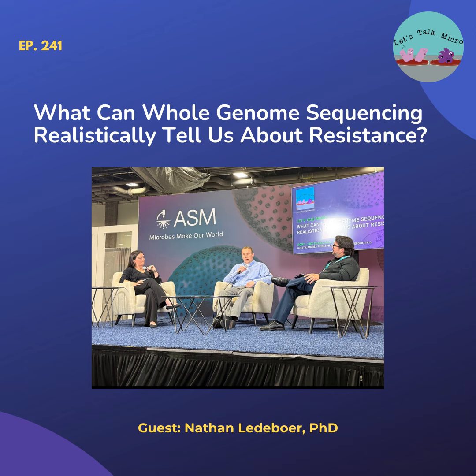Eventually we'll get to a point where we may even have a CLIA waived version of a sequencing device, where it's as simple as putting your blood specimen on, letting the instrument take over, and it will do the bioinformatics and spit out a result. Or maybe as an interim step, the instrument will do the work and digitally send the information down to the central lab for analysis, and the central lab can kick results back. But it's really important to think about those kinds of facilities. And I'll just give you an example.